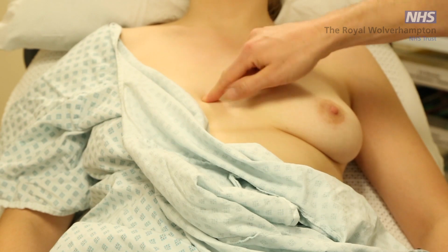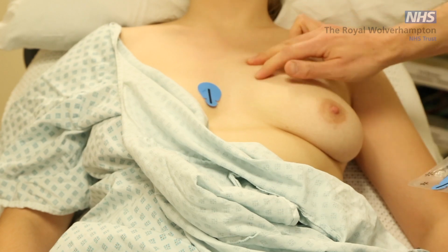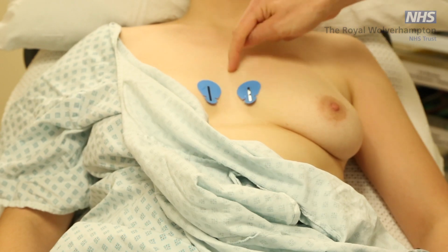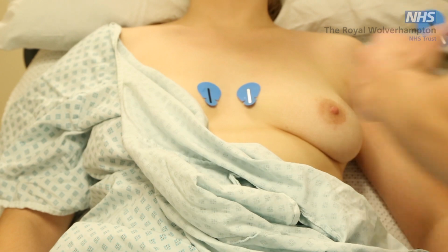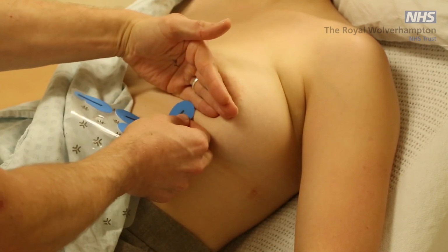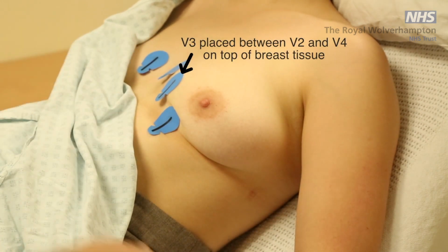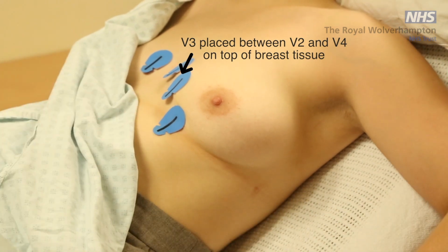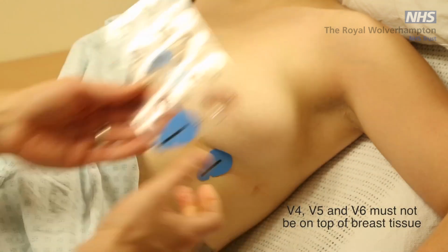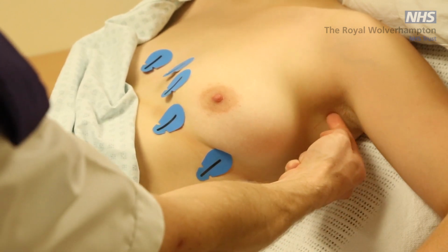When recording an ECG from female patients, it is conventional to place V4, V5 and V6 electrodes beneath the left breast, when breast tissue overlies the correct anatomical positions. There is some evidence to suggest that the positioning of these electrodes over the breast may not significantly attenuate the signal, but further supporting evidence is needed to warrant a change in this recommendation. When lifting the breast to place electrodes, care and sensitivity is required. Using the back of the hand to lift the breast can be helpful in minimizing contact.